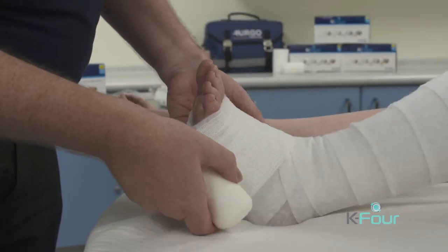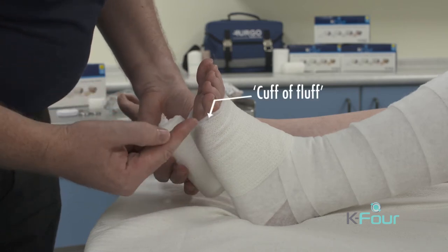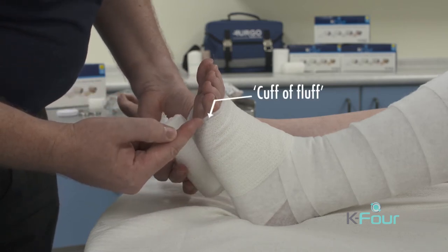Again, follow the base of the toes with the bandage. However, it needs to be applied so that a cuff or fluff is visible between the skin and the edge of the bandage.